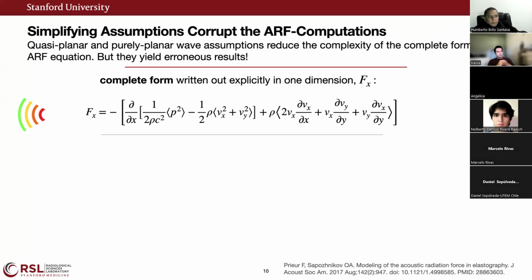And the second thing is all the variables that are used in this formula are pretty easy for us to obtain. For example, if we are using K-wave, which is a commonly used simulation software for focused ultrasound, we can easily get the particle velocities, density, sound speed, and the pressure at any point in space to be able to simulate the acoustic radiation force.